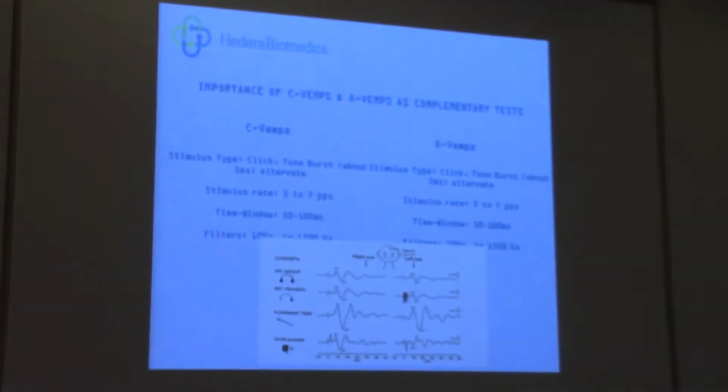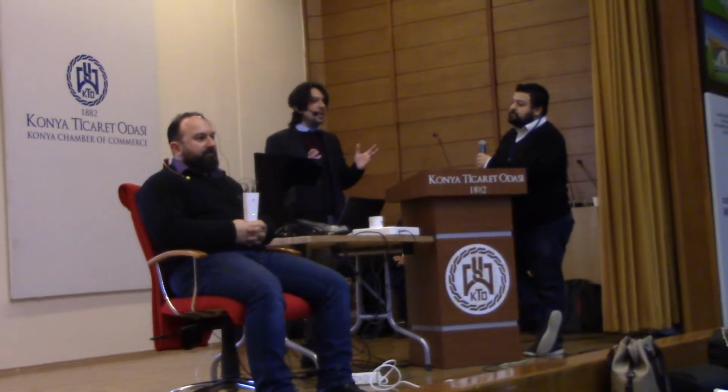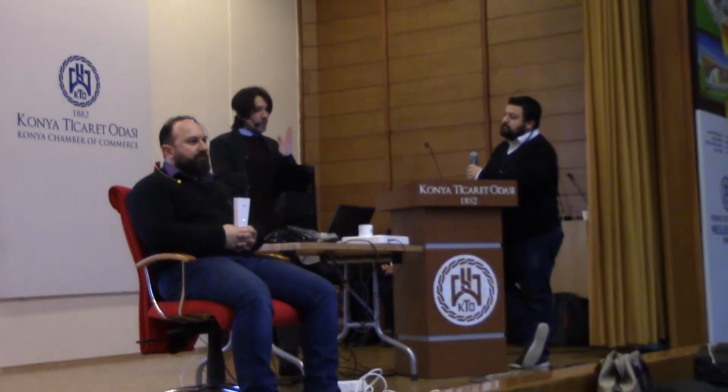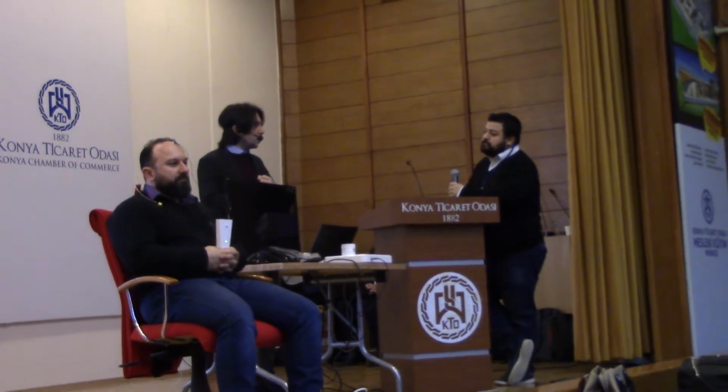The intensity of stimulation should be high for both. Consider that a threshold is around 110 dB SPL. So you know that if you have a VEMP still at 95 dB, it means there's a dehiscence, for instance. It's a hypersensitivity. So it's important to understand that if you don't give the huge intensities of stimulation like 120, 125 dB SPL, you typically cannot get a strong response.